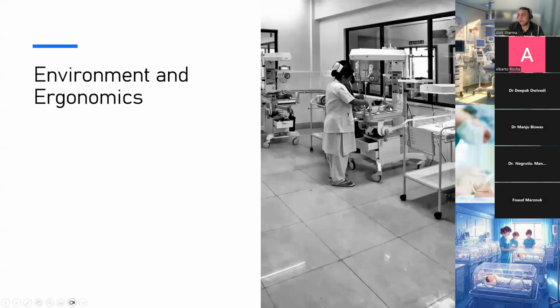So again, it's really important for you to consider machines, consider the stability of a baby. I mean, if this baby is high frequency oscillated on nitric, you know, not a good idea to touch the baby. Then really what you're going to have to do for minimal handling is basically do a left-handed inverted scan. And my colleague, Dr. Rajesh Sharma, is an absolute expert at being able to do this. He is amazing, amazingly flexible is the word I'm going to use.